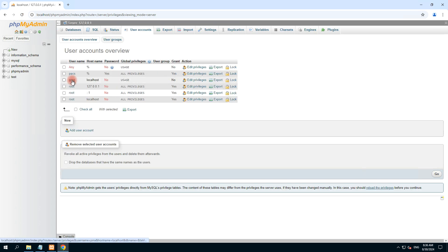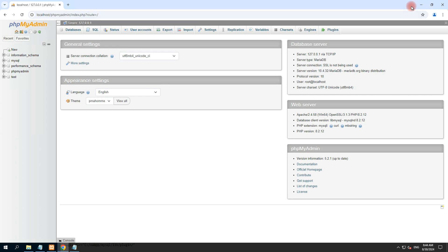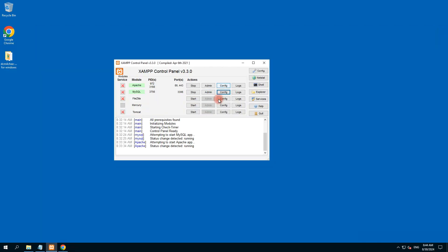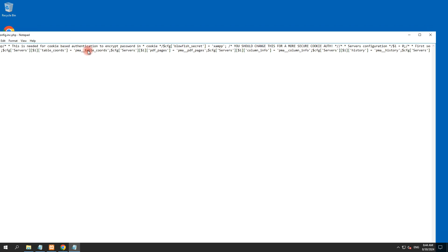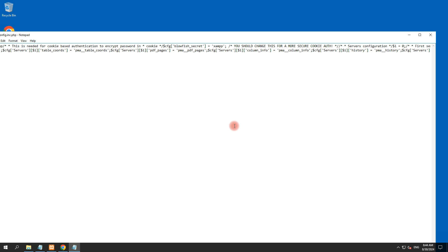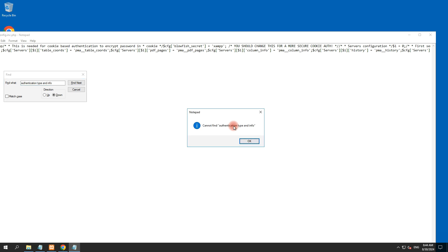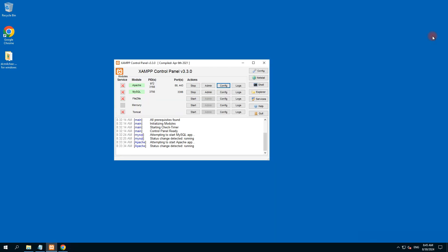We are in the phpMyAdmin local account. After setting up the user 'pacs', now we need to log in through this user and create the database. If we directly log out it will not work because we have directly opened it. So what we do is click on this config — here is the phpMyAdmin config dot inc file.